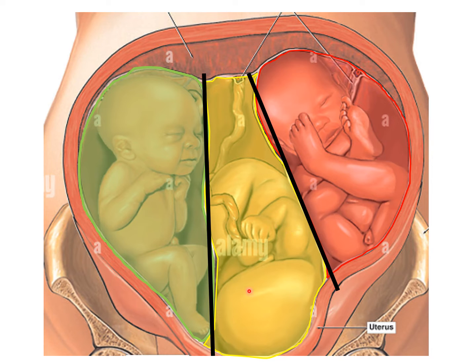And so again, we'll start with this first fetus, which is fetus A, and perform the full scan within this little sector of space. And then fetus B, which is the next closest to the cervix, will be the next fetus, and we will try to isolate this fetus the best we can with this small amount of room. And then this is fetus C, and we'll finish up with fetus C.